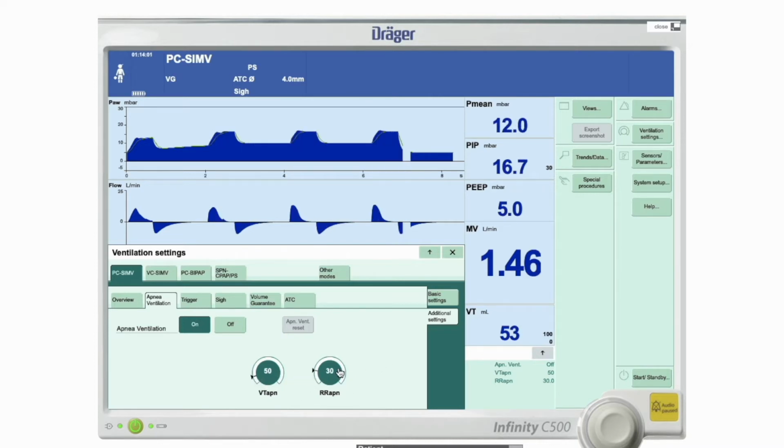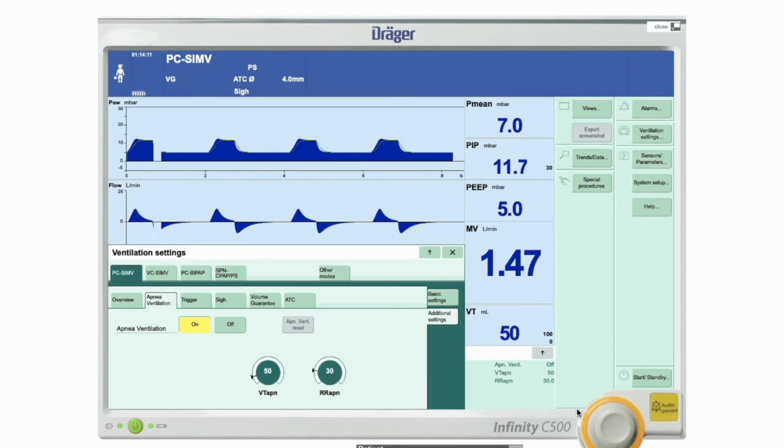When you switch it on, you can see apnea ventilation at the moment was off. Well, it should be on now because I've switched it on. So that should turn to on. I don't know why it hasn't. Maybe that's just a problem with the simulator, because on real vents it does. On the simulator, clearly it hasn't done so. But I've switched that on.